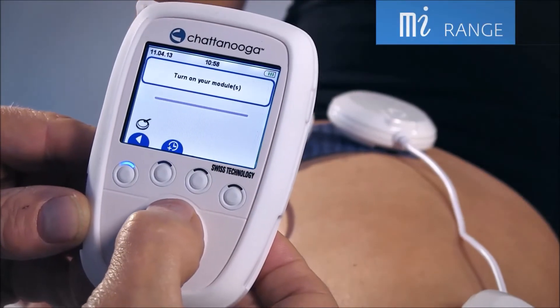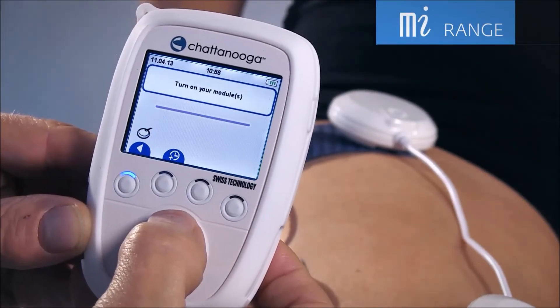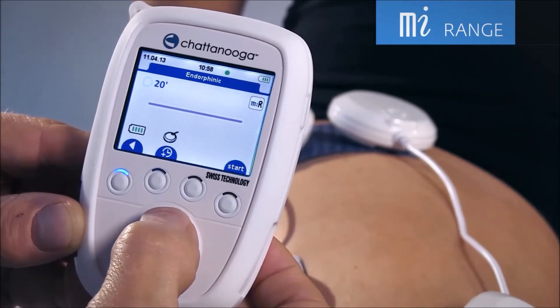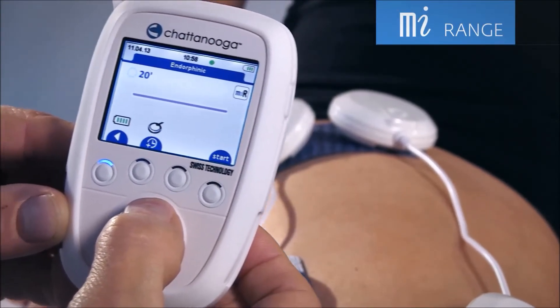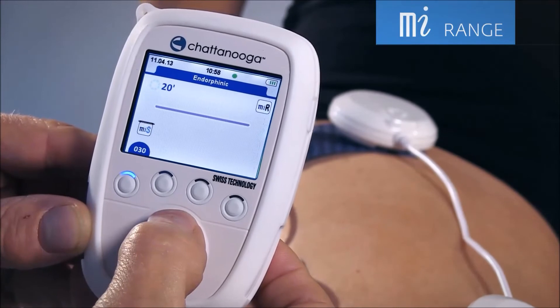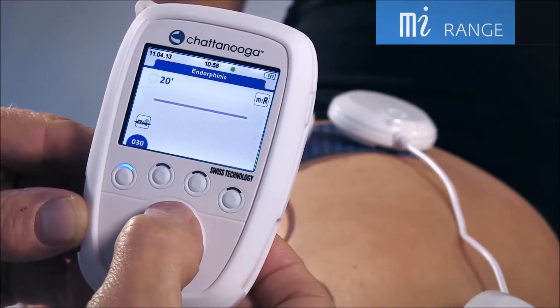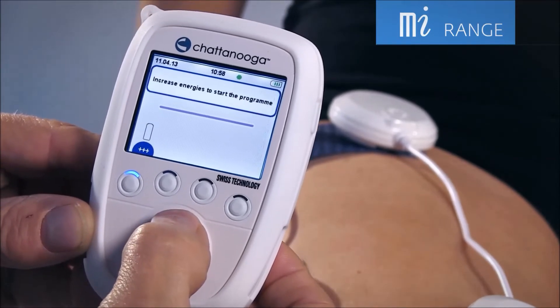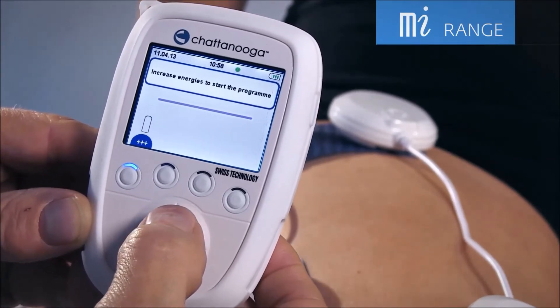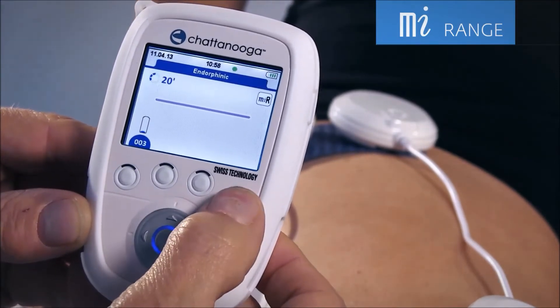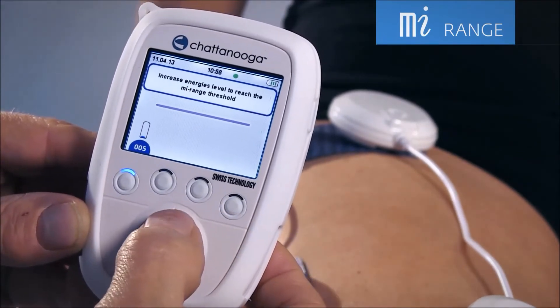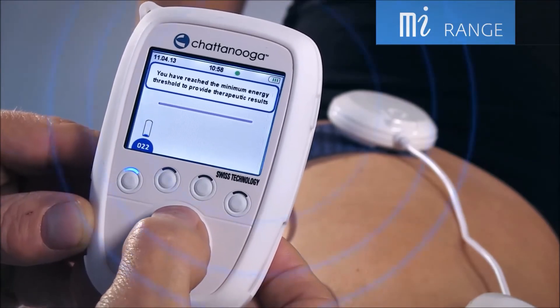MI Range – controlling intensity. In order to enhance optimal muscle twitches in low-frequency programs, the MI Range indicates the minimum intensity level to the therapist.